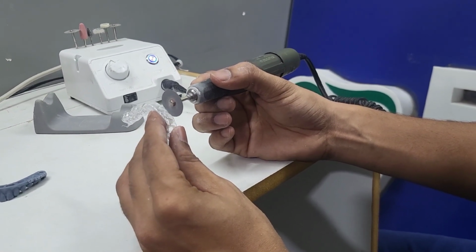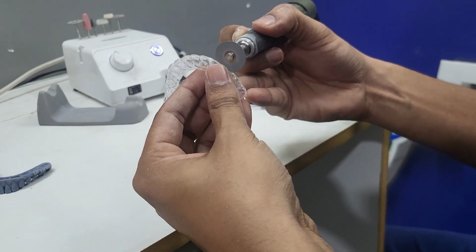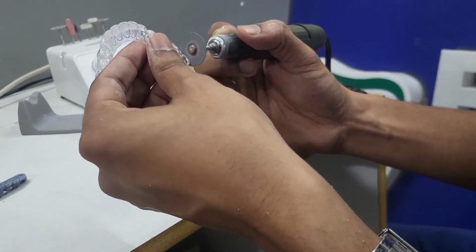Before completing, some more finishing will be needed. You can watch in the video. So fine trimming will be done at the margin to avoid any sharp edges.